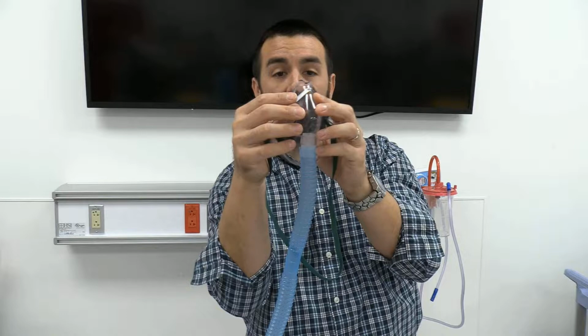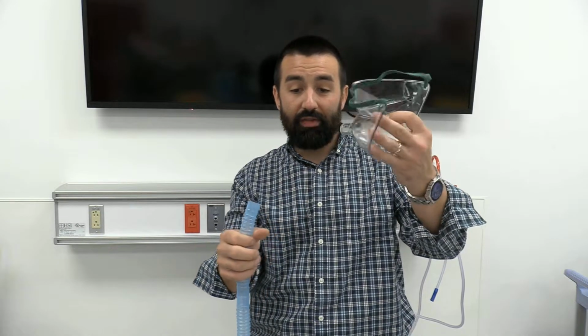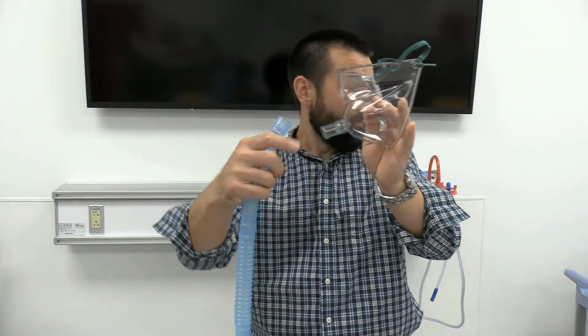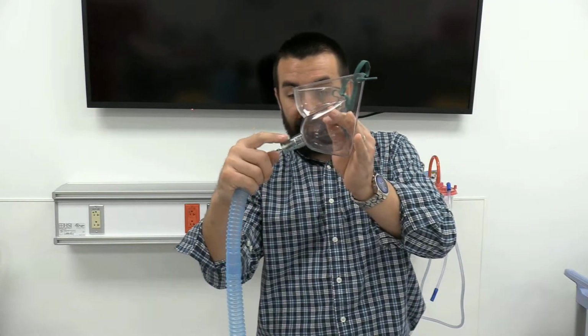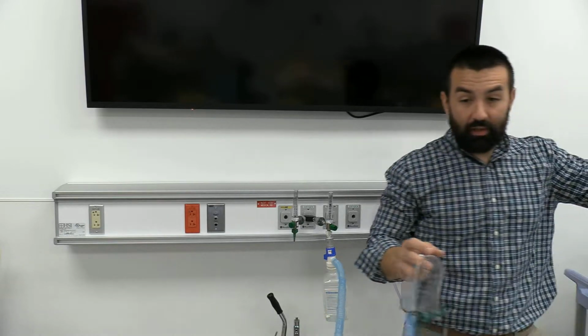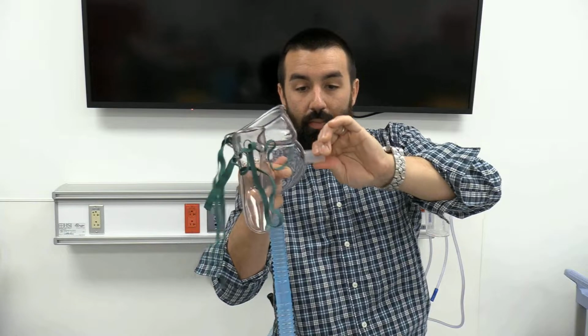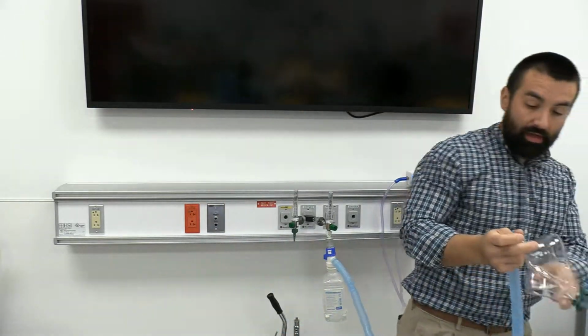A lot of times you have a patient like a smoker on a nasal cannula whose nose is burned, and we're trying to humidify, so you can't have a nasal cannula, and they don't want to wear a mask because it's rubbing. We have the face tent. You can see the face tent. This particular one has a hard fixed 22 millimeter outer adapter. Some of them do come with something like this where that adapter can accidentally come out, and then you need it to hook back in. So be careful if you're pulling that thing up and out of there.